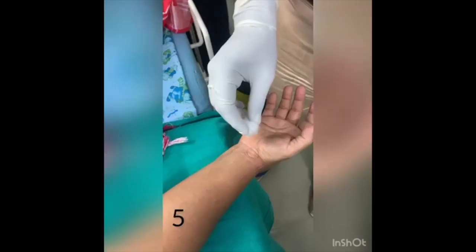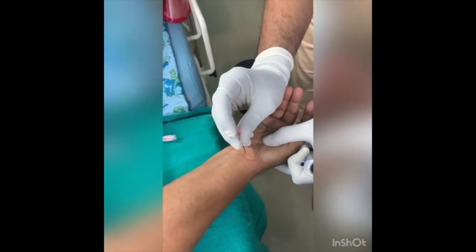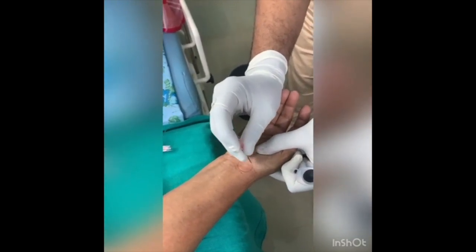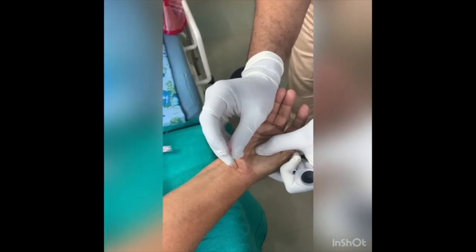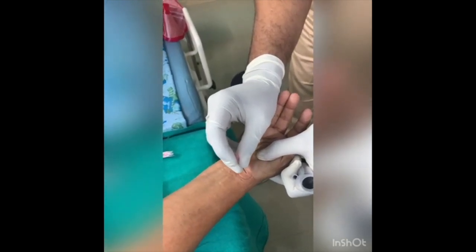Before doing the procedure, always check for systemic illness. Here I am using a number 18 needle to make the prick, or we can use a number 12 surgical blade for the same purpose. It is very effective in grade 2 carpal tunnel syndrome.